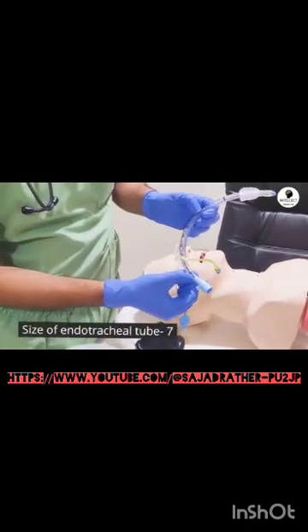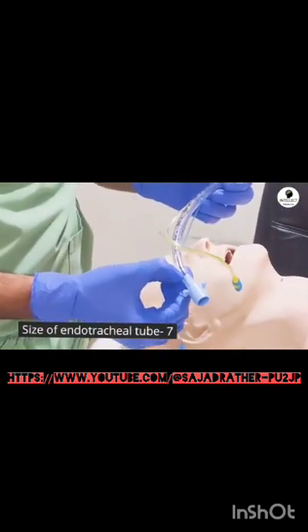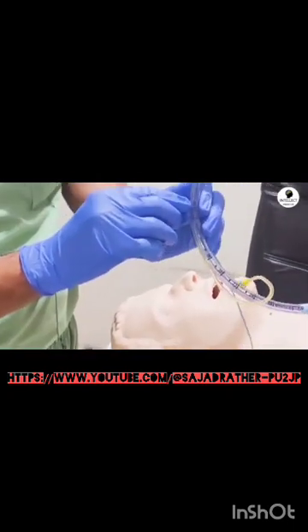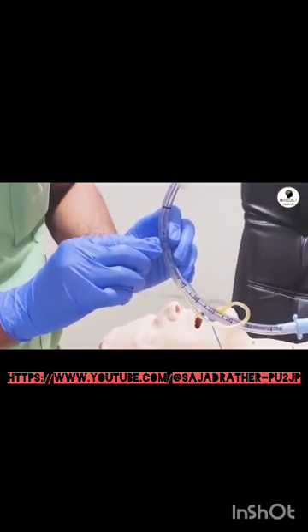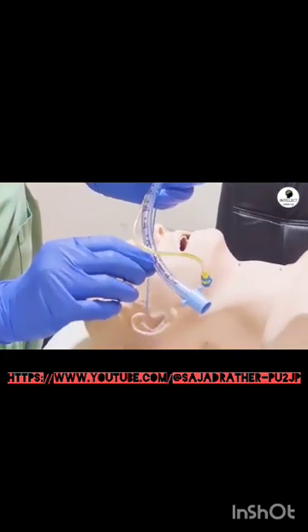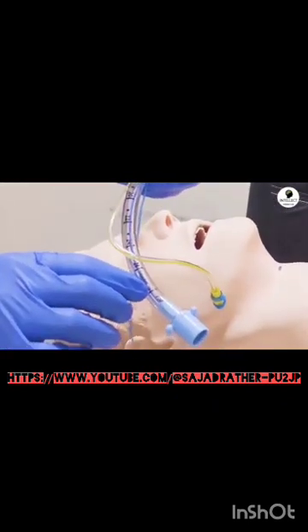And this 7.0 suggests the size of the endotracheal tube is 7, right? That is the internal diameter. It is written over here as ID 7.0, right? And starting from 18, it is till 26 centimeters and 28 centimeters, right?